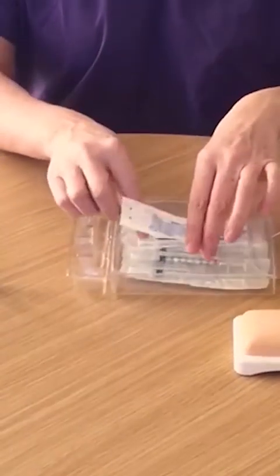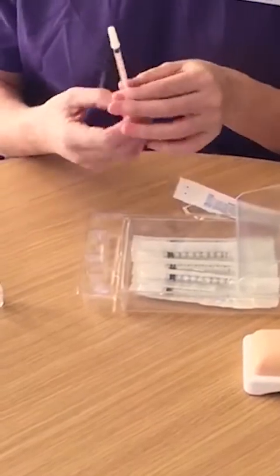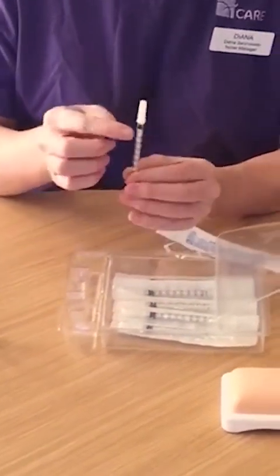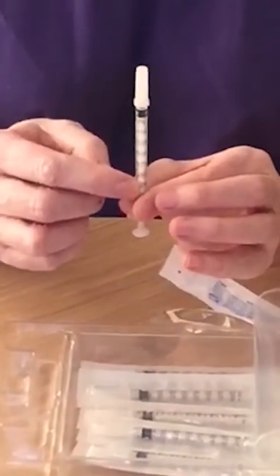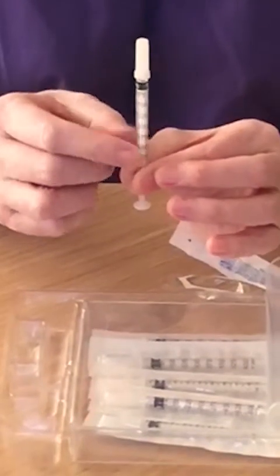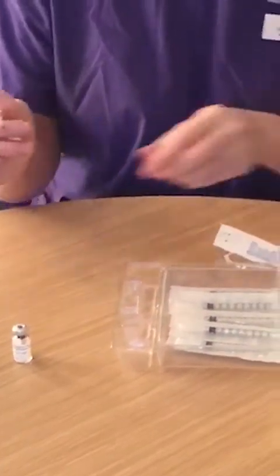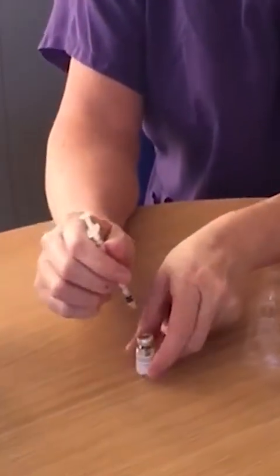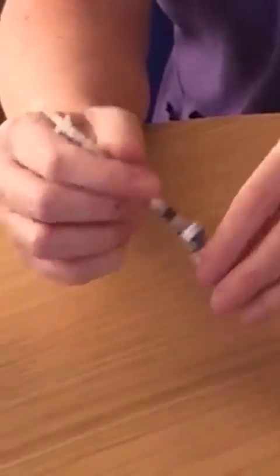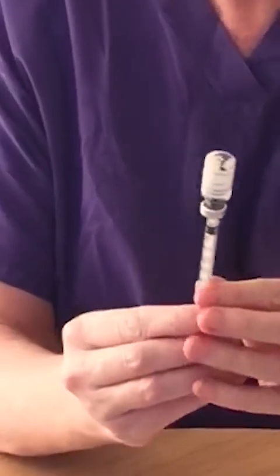To prepare your injection for administration, take one of your syringes supplied in your box. On the side of the syringe you will see the marked doses. You would administer the dose that has been prescribed by your doctor. Remove the cap from the syringe. Place the syringe through the middle of the rubber bung on the vial and then invert the vial on top of the syringe.